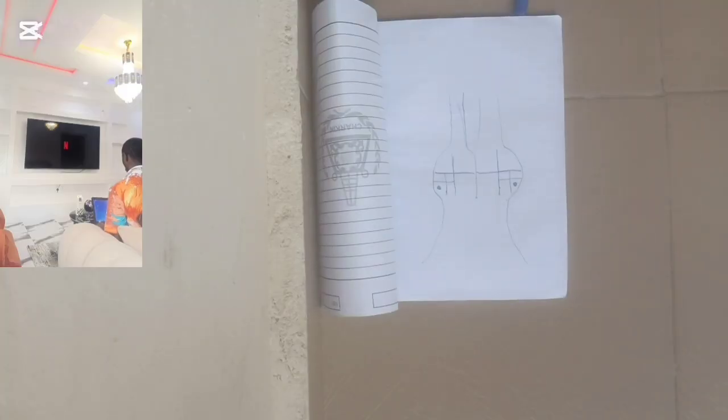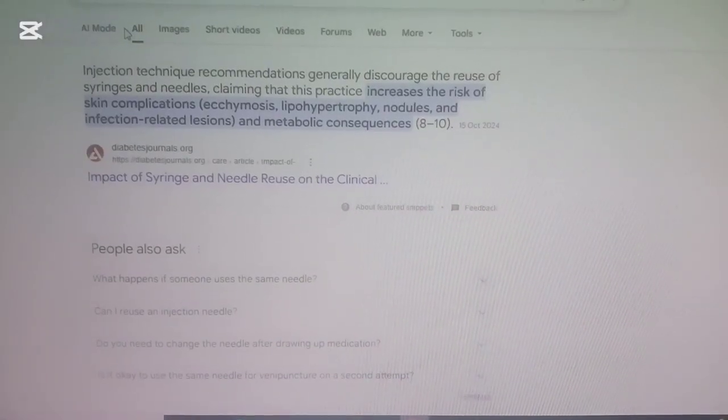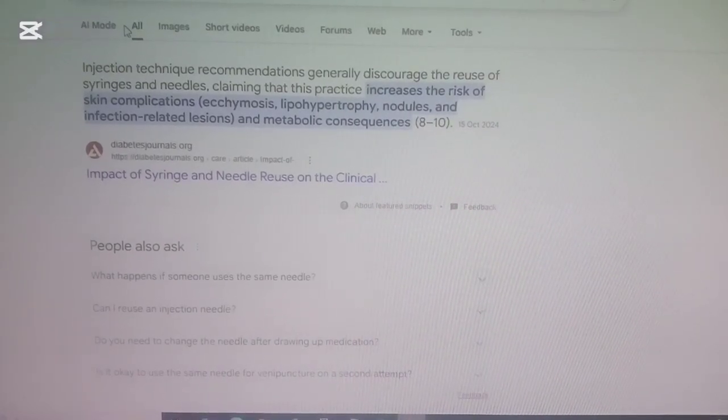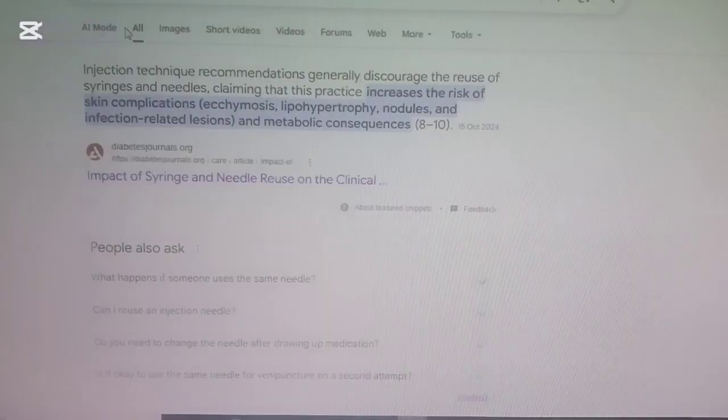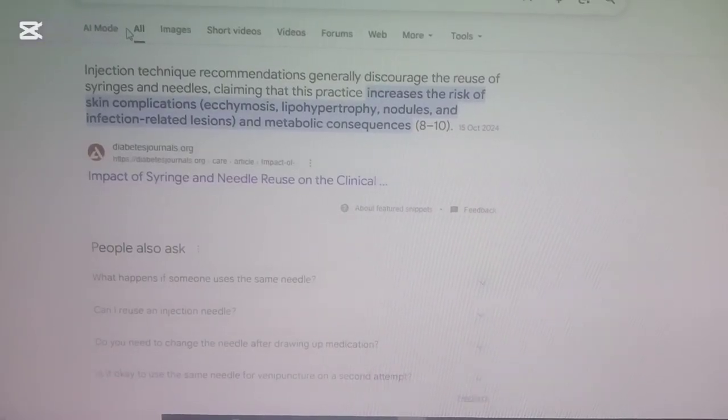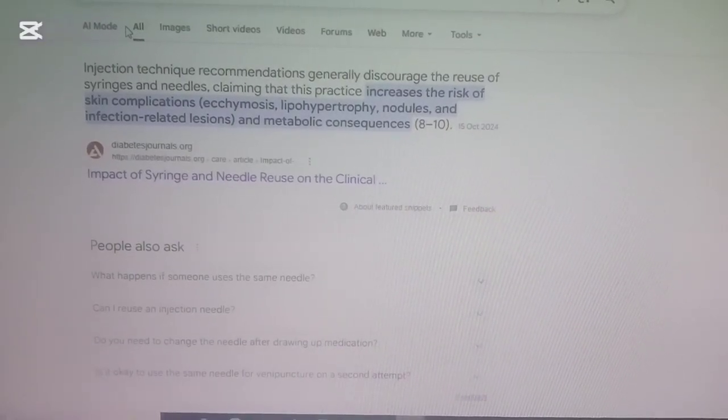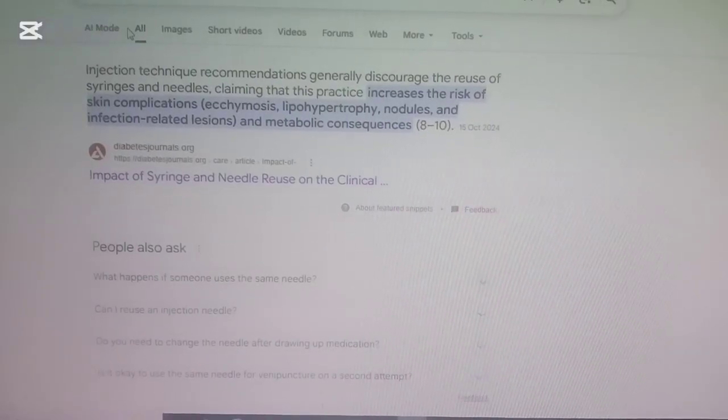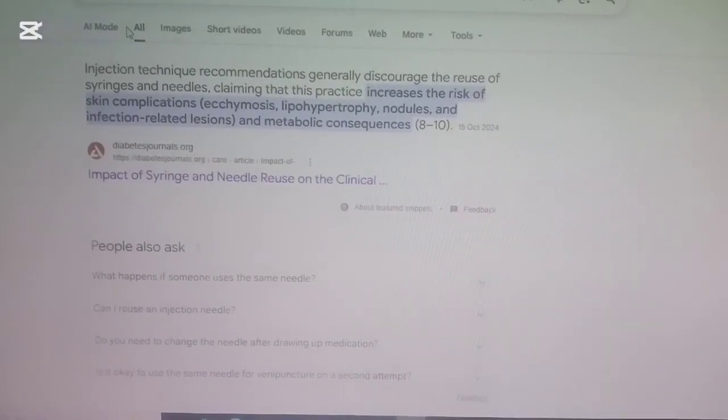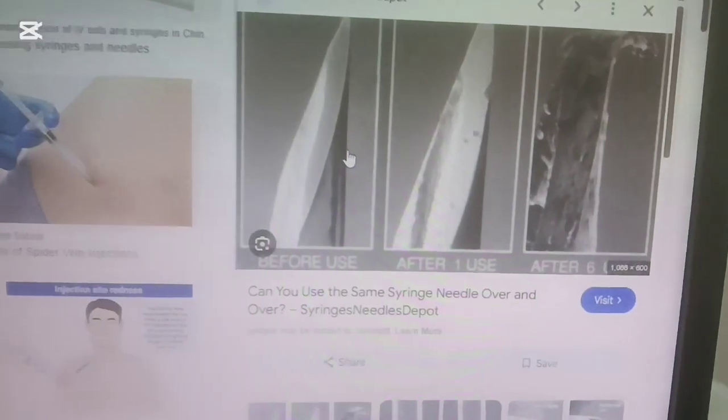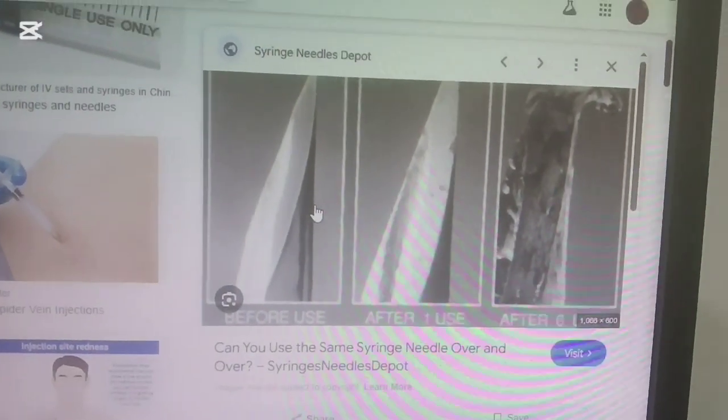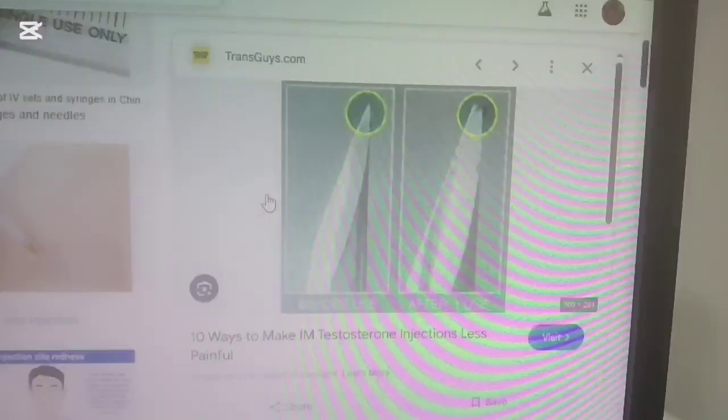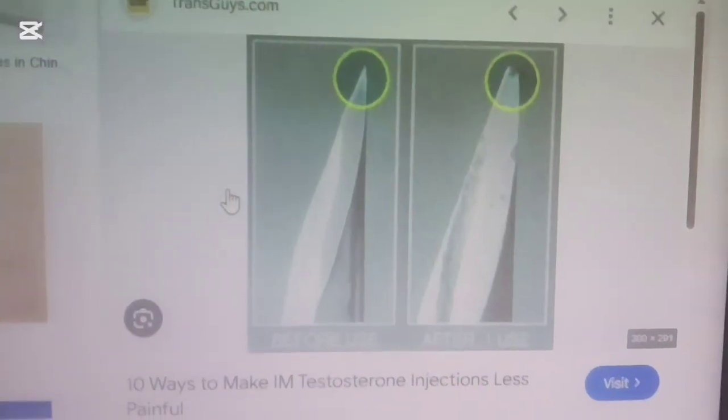This is the side effects you can get from using the same needle after you must have aspirated from an ampoule bottle to administer into a patient's body. It has been discouraged to reuse that syringe or needle because this practice would increase the risk of skin complications such as ecchymosis.